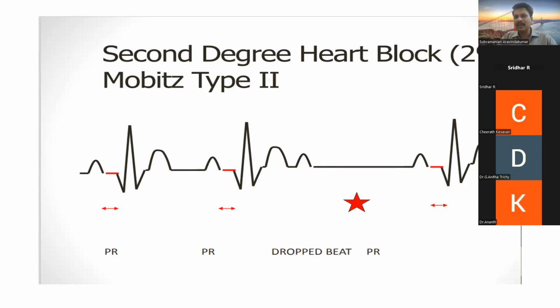Now you understand, Mobitz type 1 is much more friendly to us. It is not so much pathological. Usually it is reversible. Whereas here, infra-Hisian means the patient has got a dangerous problem. Intermittent loss of conduction can progress to complete loss of conduction very quickly.